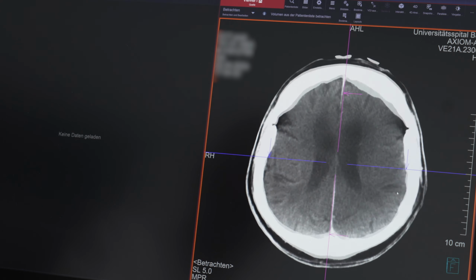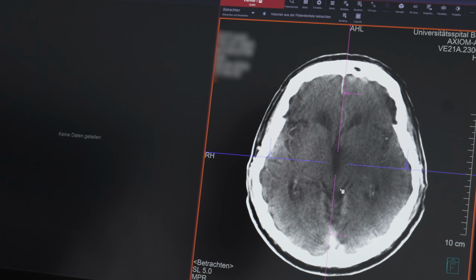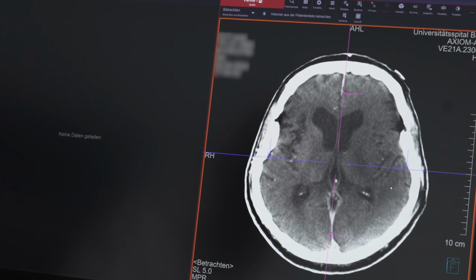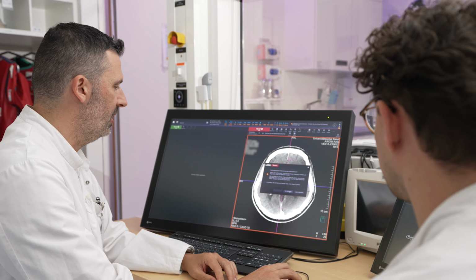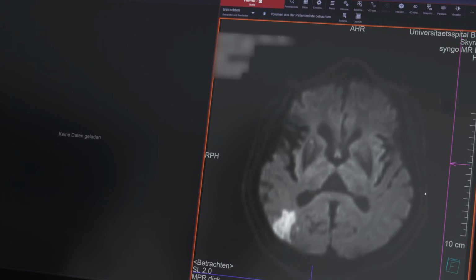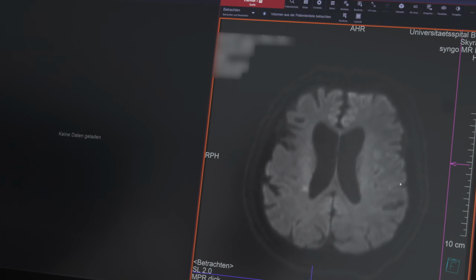This is the final DynaCT, where you can see that we don't have any bleeding, right? Even those small SAH that you sometimes see after thrombectomy of distal occlusions, there is none of it here. What we also want to see is the MRI after 1 day, right? Yeah, it also kind of explains the good clinical outcome with NIHSS of 0. So you can see that the majority of the MCA territory looks good.